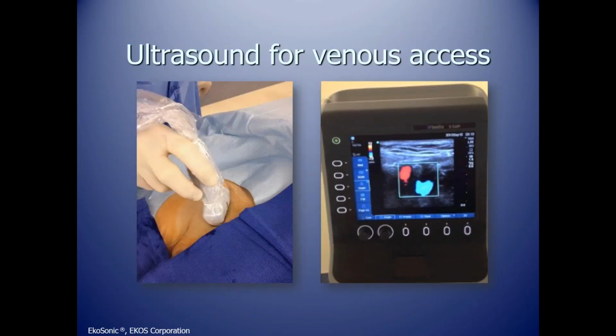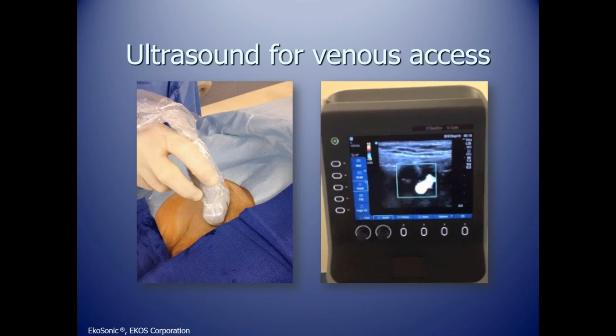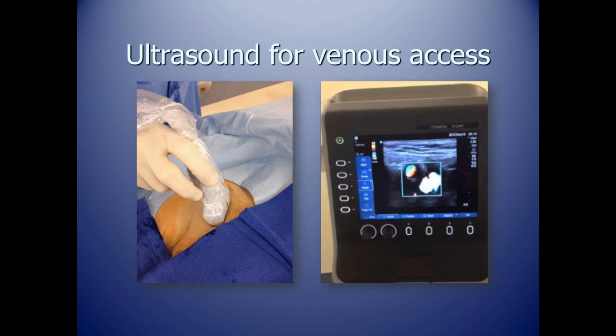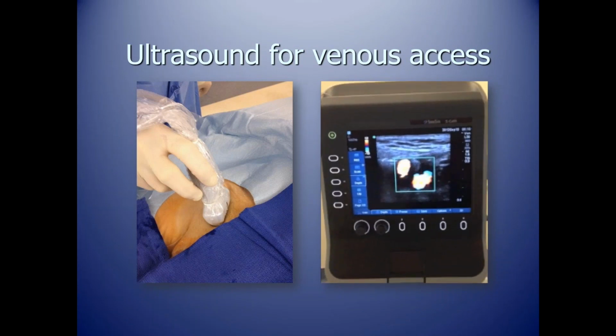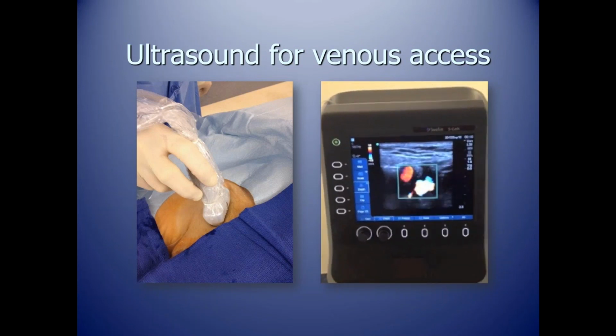And so here's sort of point number one. We use ultrasound guidance for all of our venous access for thrombolytic infusions. We've been doing it for many years, not just for pulmonary embolism. In a second, we'll talk about the choice of access.